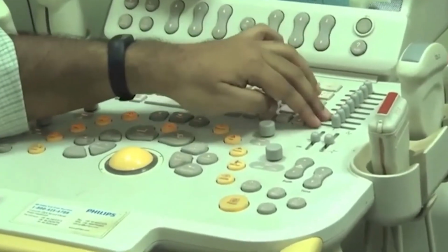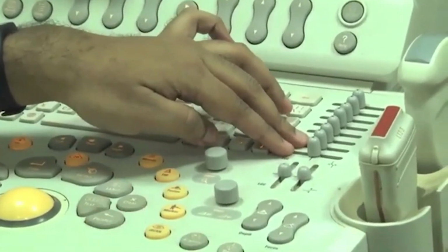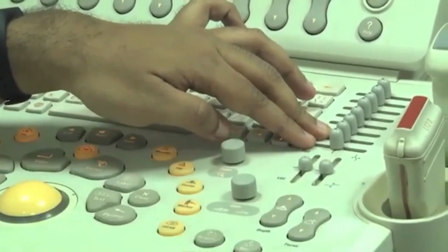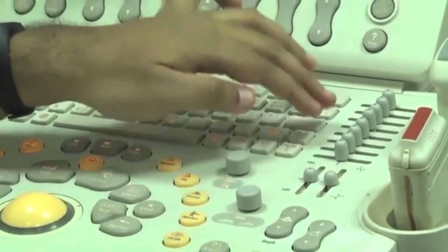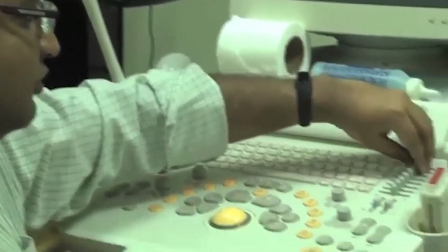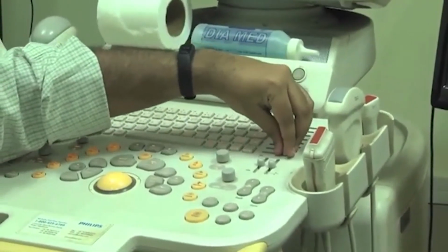The first one is called the time gain compensation. Since ultrasound propagates, we have looked through those equations and the total derivation as to how the energy attenuates as it goes to deeper tissue. For that reason, you will have to amplify signals coming back from much deeper down. So basically you need to attenuate signals which are very close to you and amplify signals very far off from you.